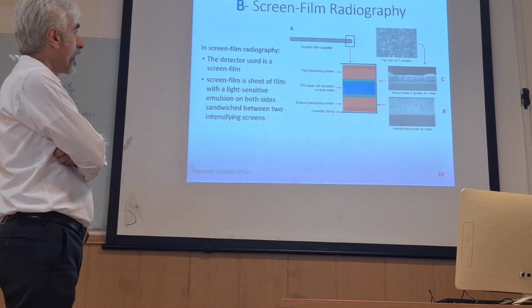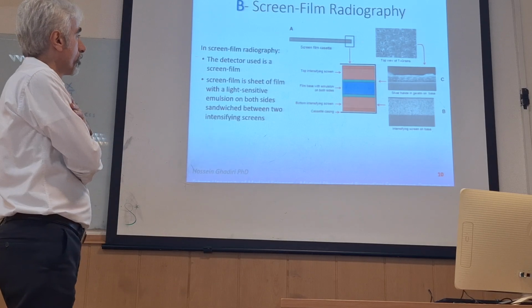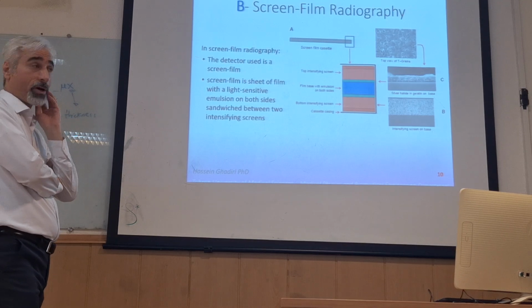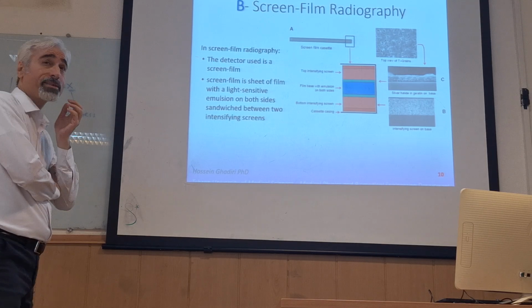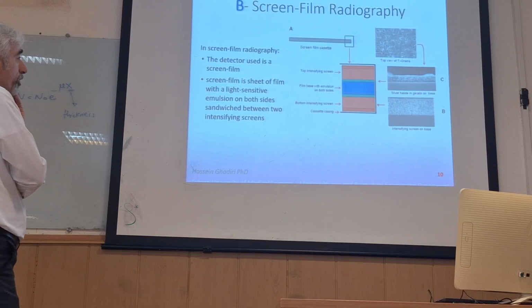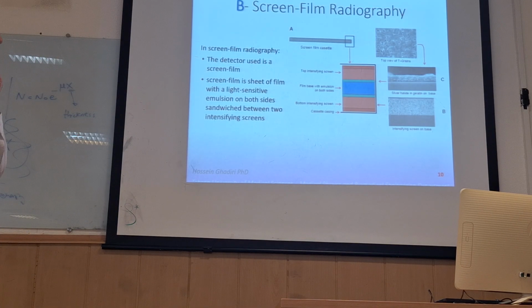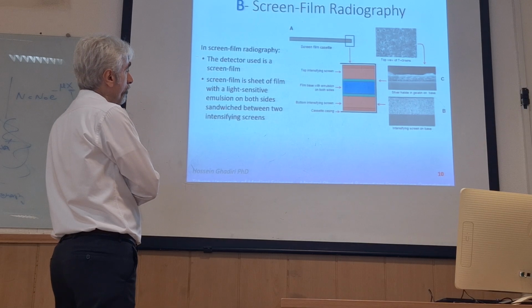As I explained, we have screen film. In radiography, we have a screen film as well. Mostly in radiography it was very common around the world. Newer machines are mostly digital, but screen film has been used for more than 30 or 40 years in radiography machines around the world. Many companies around the world were manufacturing their screen film, like Kodak. Kodak is a very famous company which designed and manufactured the screen film for medical applications.